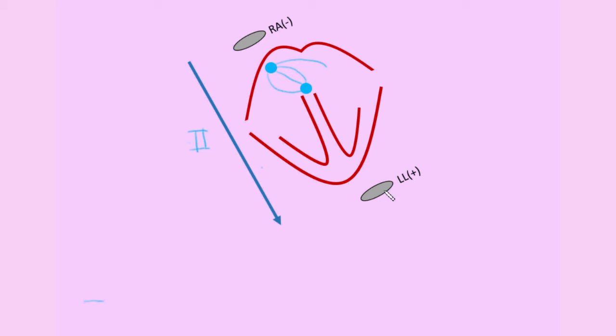From the point of view of this electrode down here, these waves of depolarization are moving towards it. So that would give us a positive deflection on EKG. And so here we have our P wave. After the depolarization gets to the AV node, there's a little bit of a pause to allow filling of the ventricles. Since there's no electrical activity during this pause, we get another flat tracing on the EKG.